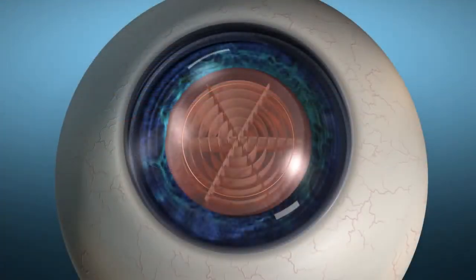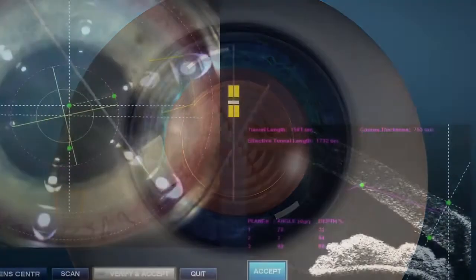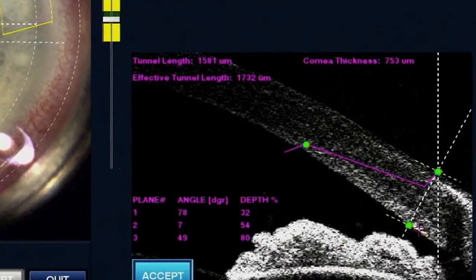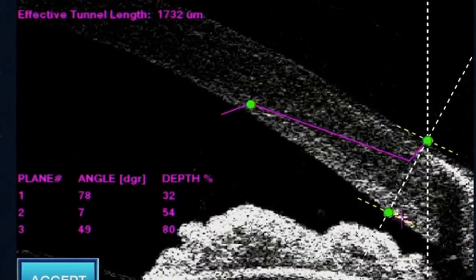Finally, arcuate and primary and secondary incisions are created. Trapezoidal incisions may be selected to create multi-planar primary and secondary incisions. The entire procedure, from applanation to treatment, takes less than two minutes.